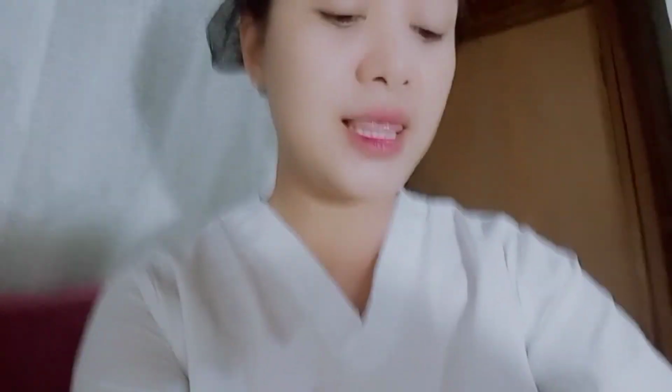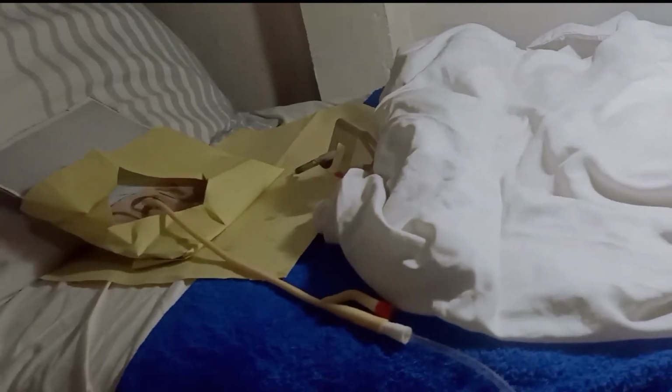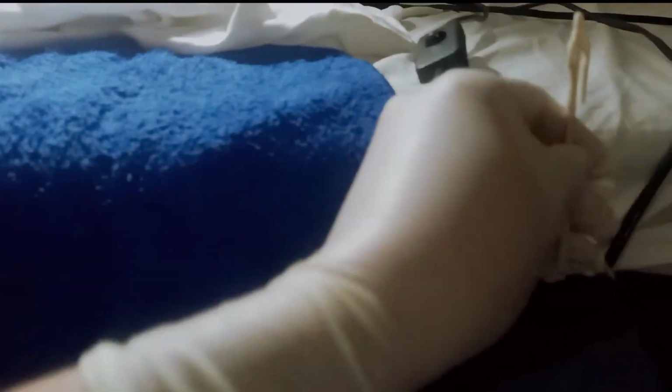After that, when putting the urinary drainage bag, we should put the tubing on the thigh, not under the thigh, to avoid backflow of urine that can cause infection to the client. You should put the drainage bag below the hips of the client, on a non-movable area. Hook it that way.